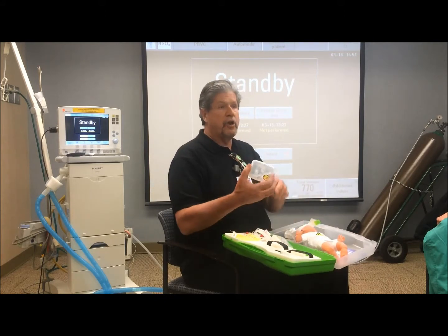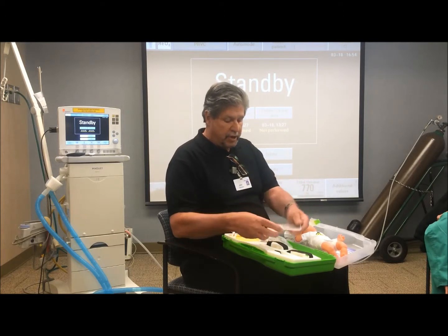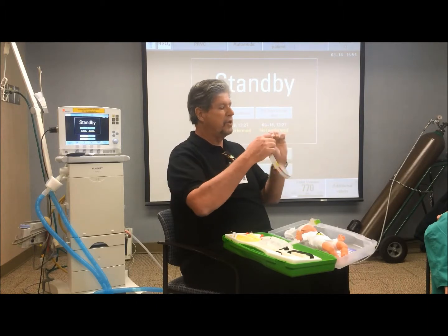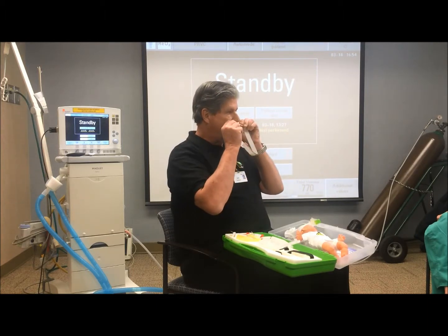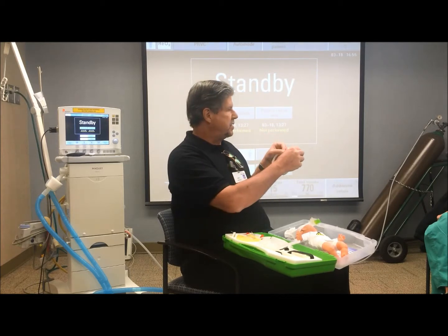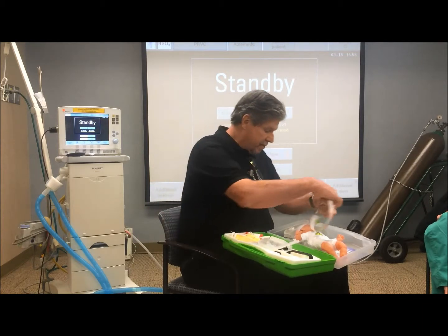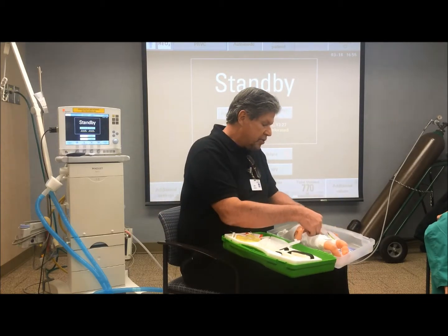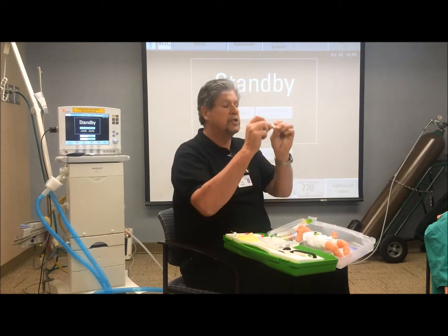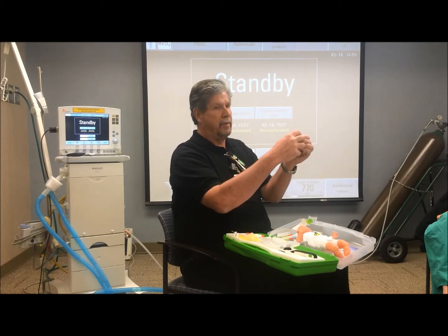So let's say you wanted to start with prongs first. So you would then pick the appropriate size prong using, once again, your little tape measure. So you can put this up to the nares and try to estimate what size prong you would use based on these nares. So then you say, okay, this baby is pretty small, so I'm going to use the smallest prong. So you find, I think that's the smallest prong, and they have holes in the back of them.